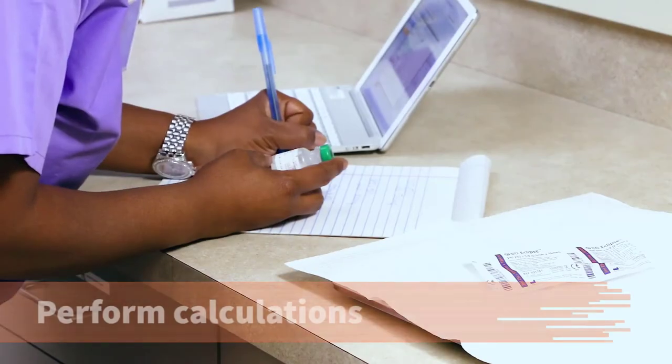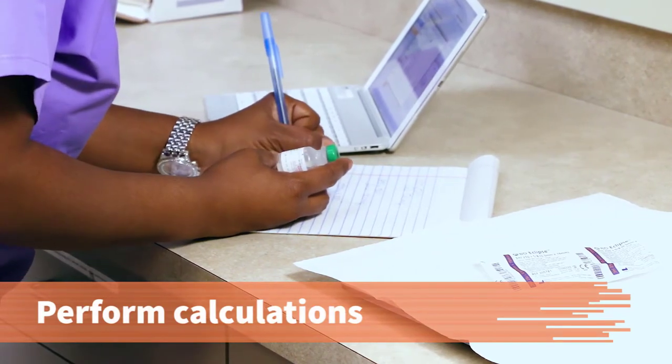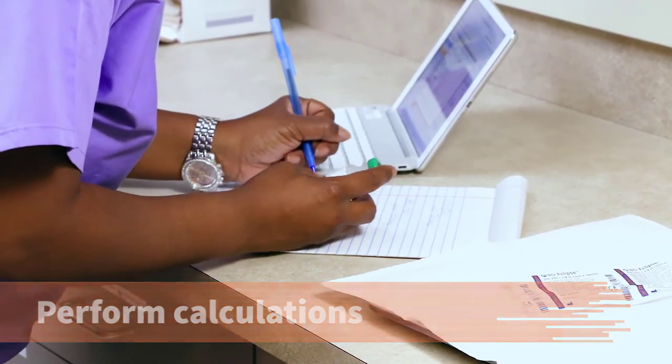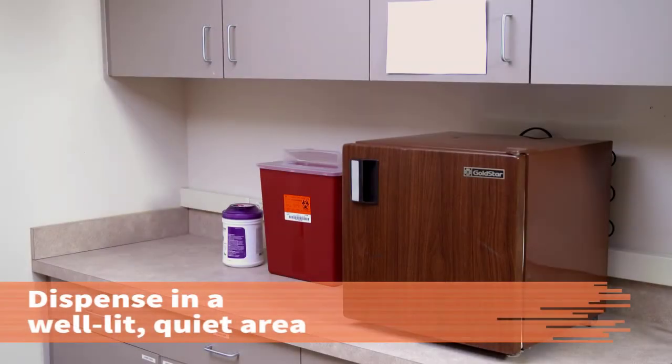Perform calculations needed to match the provider's order. Confirm the answer with the provider if you have any questions. Dispense the medication in a well-lit, quiet area.